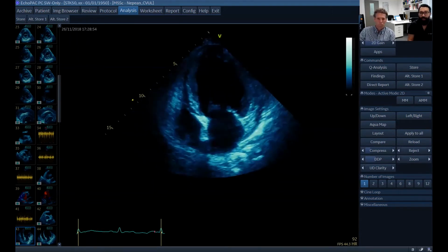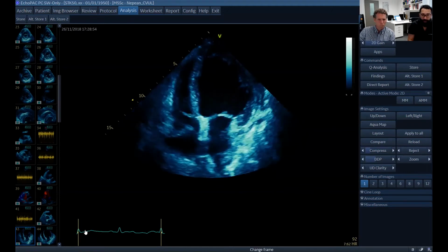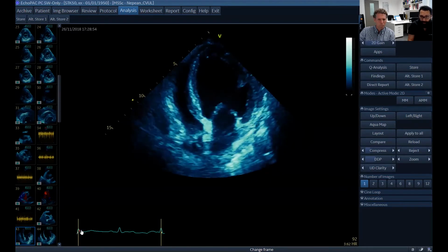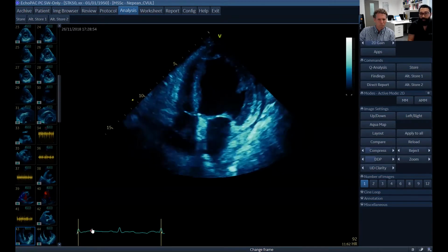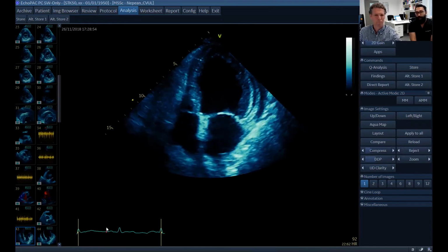However, you can make it more specific if it is collapsing for more than 30% of the cycle. So if we stop it and see when it's collapsing, ideally what you would anticipate is in systole, which is what we predicted, and it looks to be more than 30% duration, which would correlate with more severe intrapericardial pressures, which are causing the compression. Nice.